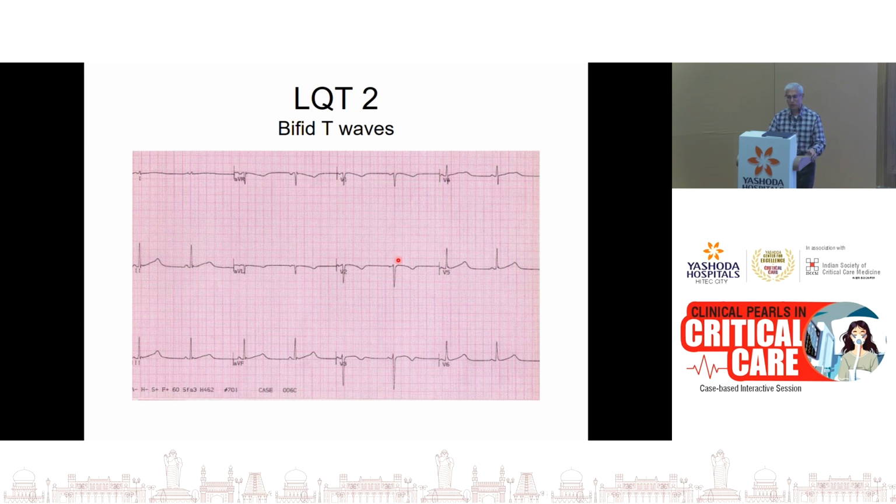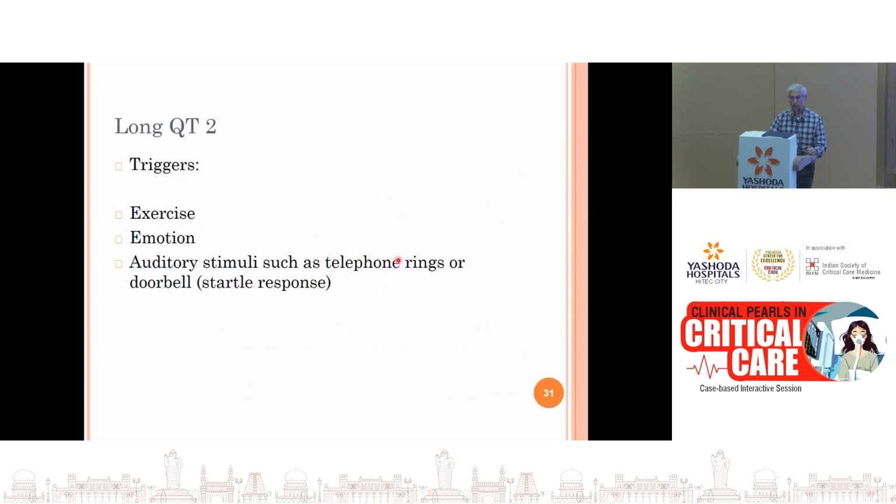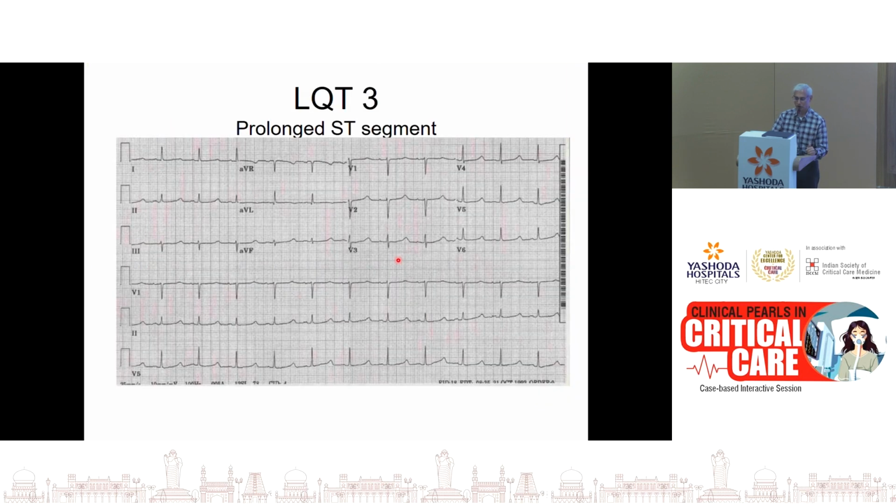And long QT2 is characterized by the presence of notched or bifid T waves. And in these patients, typically more than exercise, emotion and startle responses like auditory stimuli, like sudden ringing of a bell, a sudden sound, or a sudden doorbell ringing, these often precipitate syncope in these patients.